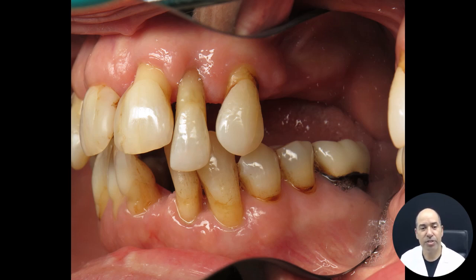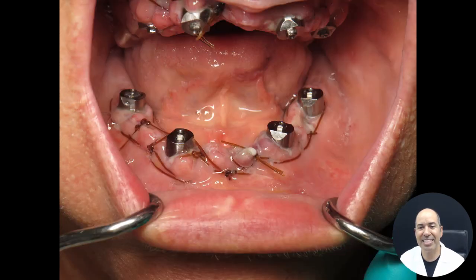So in a single surgery, there's some pictures that may be a little bit bothered. There's no surgery photos, but this is what things look like the next day. So these are dissolvable stitches. You can see that she has very small jaws, not a lot of room for implants. There's 4 implants per jaw. You don't want to have too many.